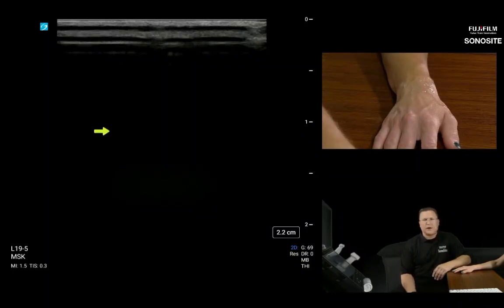As far as memorizing all the names of the compartments, not important unless you suspect actual pathology. But I would encourage you to label at least compartment 1, 2, 3, 4, 5, 6 instead of getting into the weeds of all the names. That'll at least show that you did a general survey of those extensor compartments. You want to also document that you looked at the joint and the cartilage.